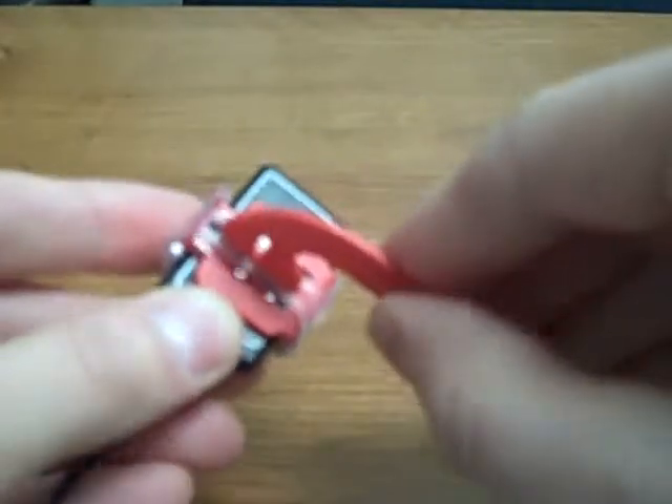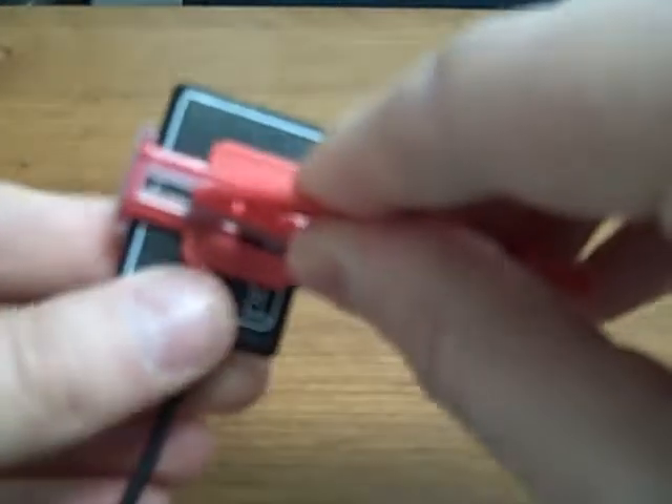This is the bite block for vertical bite wings. You can see it with the size 1, and here's the size 2 with the vertical bite wing.